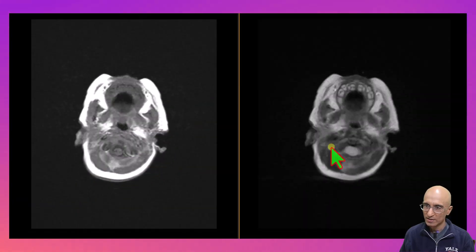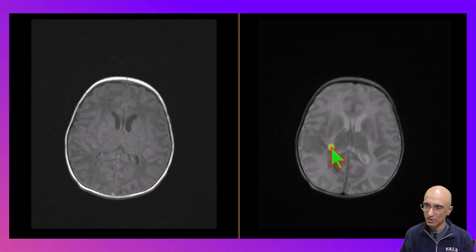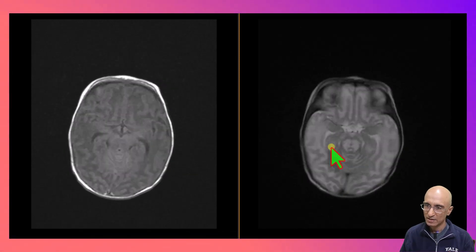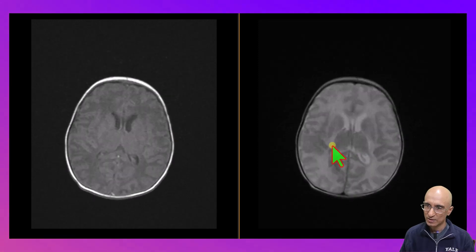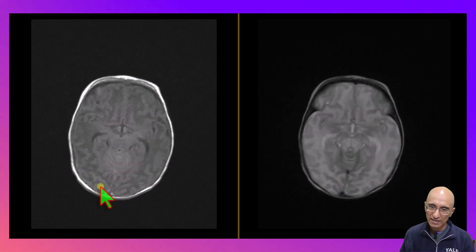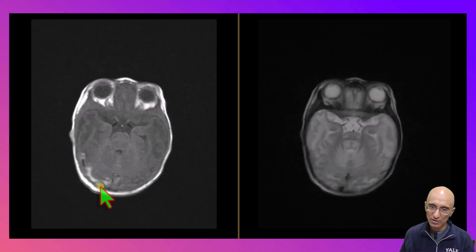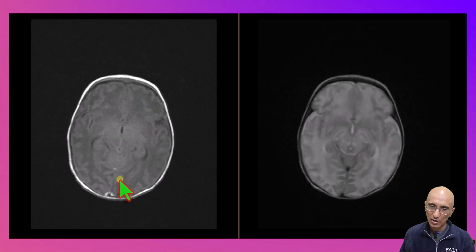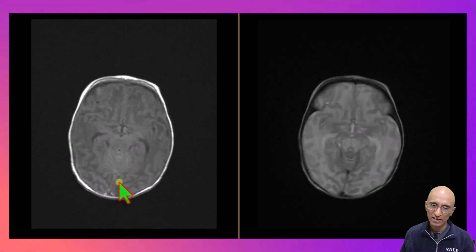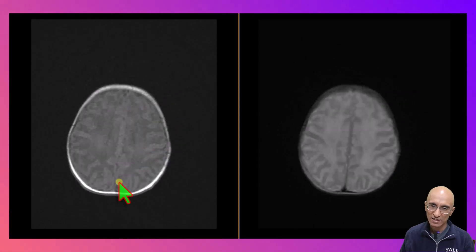On the proton density and T2 images, which are on the right of the screen, you can clearly identify edema in these regions. There is also suggestion of slightly diffuse edema in the white matter, although this can be challenging in the neonatal period. On the T1 axial images on the left, you can see a small amount of subdural hemorrhage along the posterior convexities and the tentorium, which is not an uncommon finding in normal vaginal delivery.